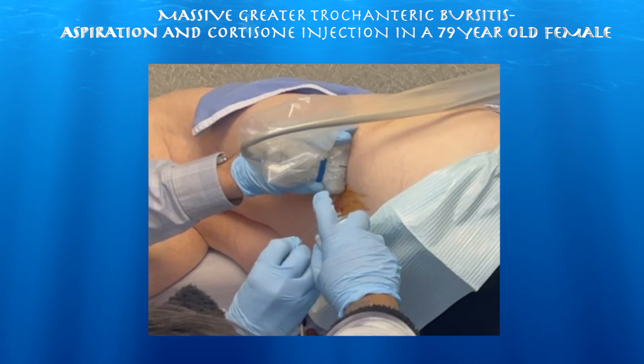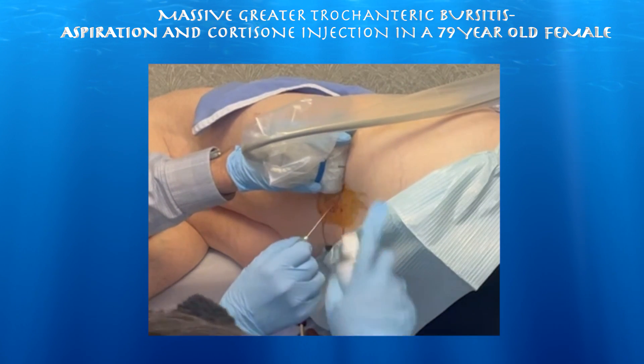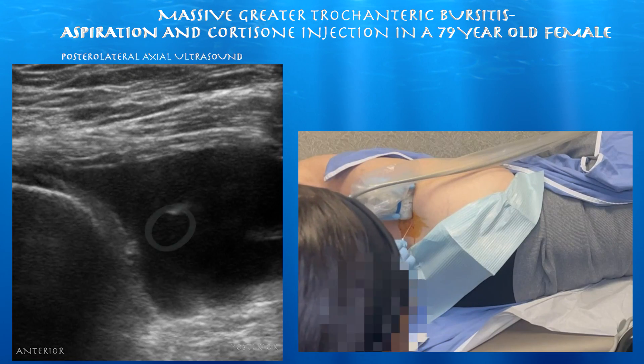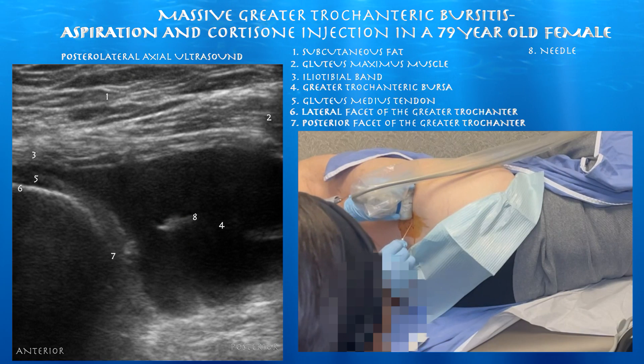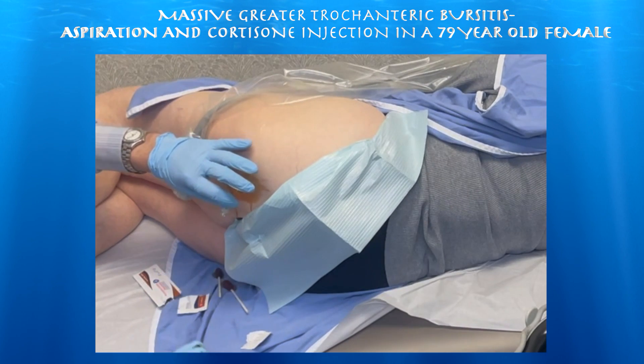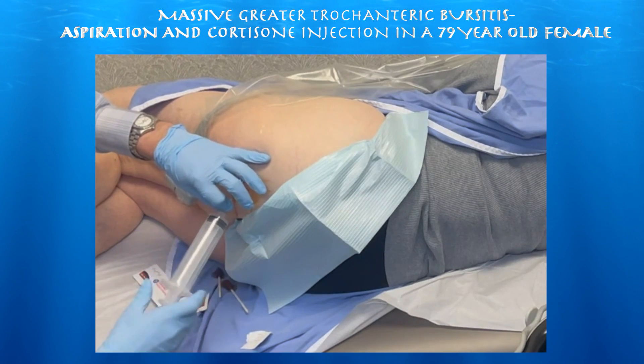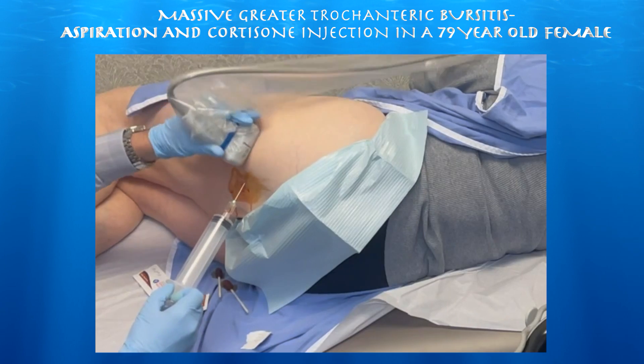We're going to go ahead and use a spinal needle to get into that bursa and drain it prior to the cortisone injection. You can see the needle tip within the middle of this bursa. We used a 22 gauge spinal needle, which was a bit thin for this procedure. I would use at least a 20 gauge needle when doing these aspirations, as it took several minutes to get most of the fluid out of this very large bursa.